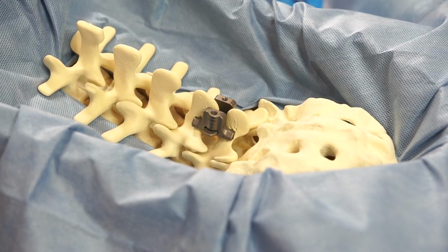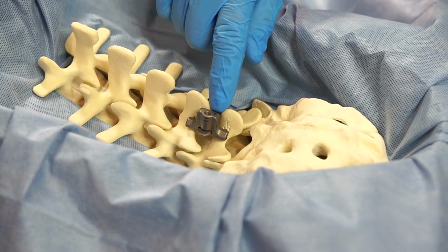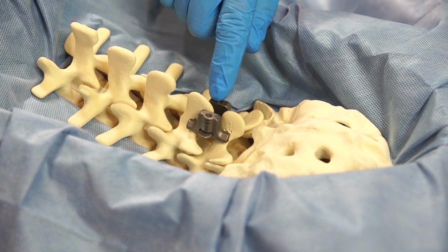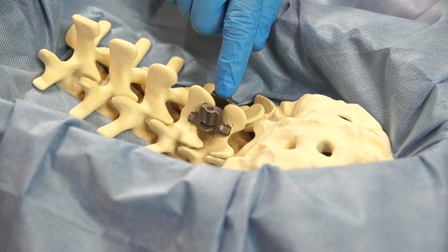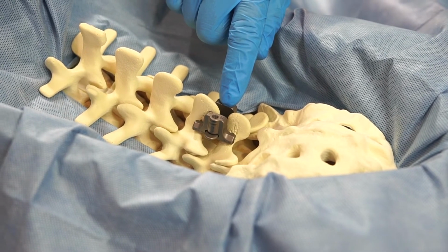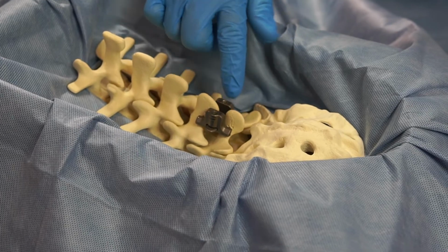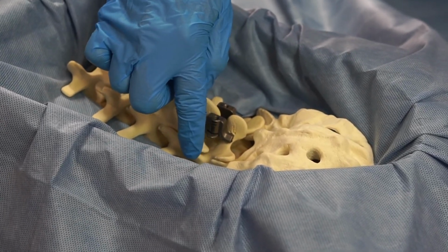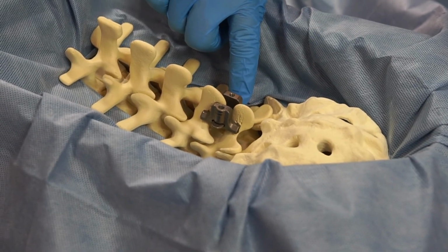If the supraspinous ligament was resected, bone graft may be packed posterior to the device between the tips of the spinous processes. The anterior tray design creates the perfect containment area while protecting the dural space. If fusing through the facets, decorticate articular surfaces and place bone graft in the usual manner.